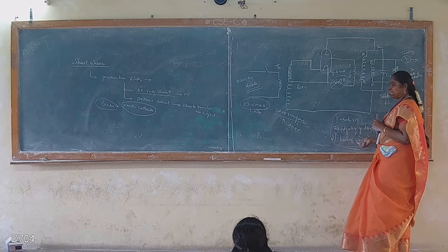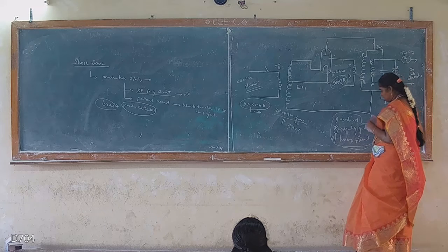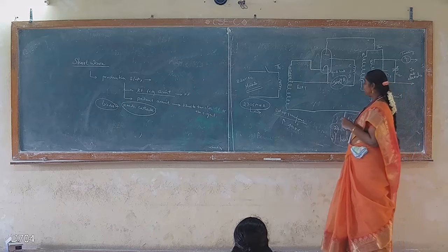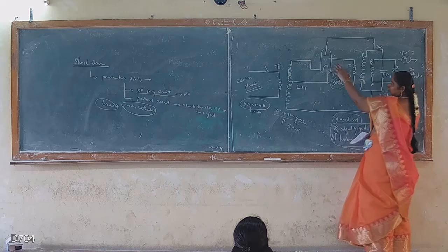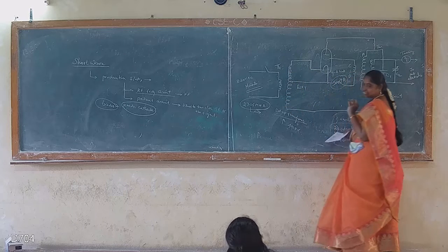But even though there are three ways, the one which is suitable, or best, is always just adjusting the grid bias only. Why? Because if you want to adjust the anode voltage as well as heat the filament, the voltage must be adjusted.